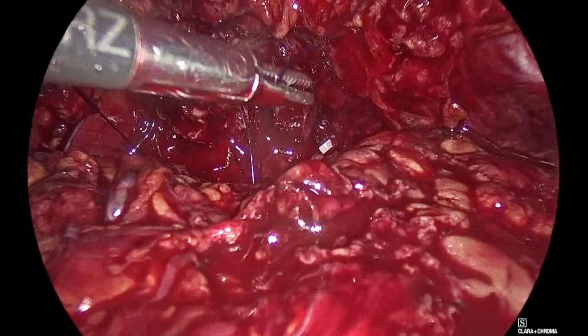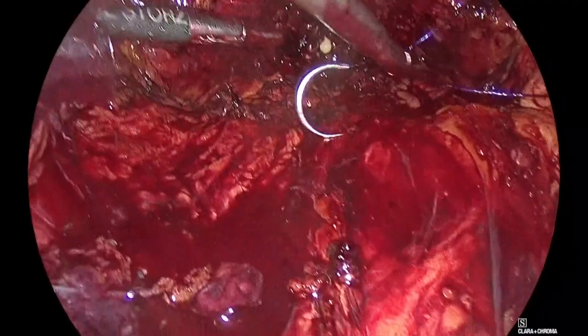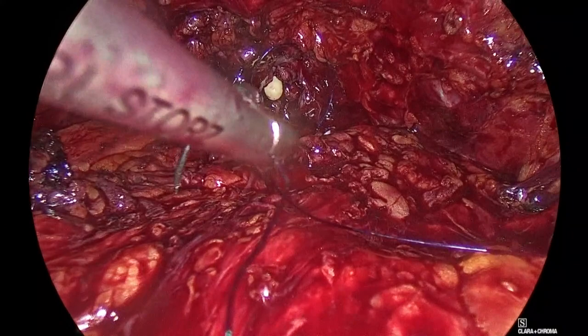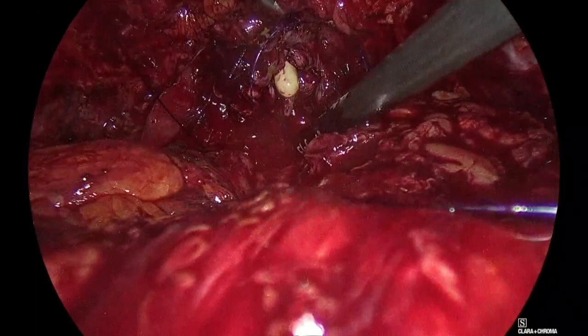Good. Go back. Needle. Please explain to us, what are your issues concerning the Rocco stitch? I think that the Rocco stitch... Tension on... But do you see any tension here? It comes down without pulling it. So I think that the Rocco stitch is needed because of robotic surgery and the extreme Trendelenburg. Here, if I want, I flatten the patient completely. We did a study some time ago and didn't find any difference. But in laparoscopy, I don't think this is an issue.